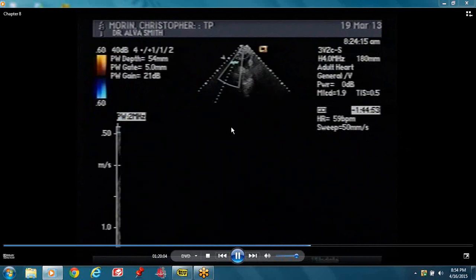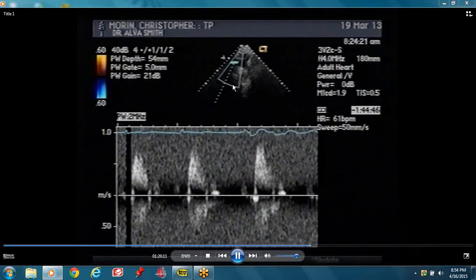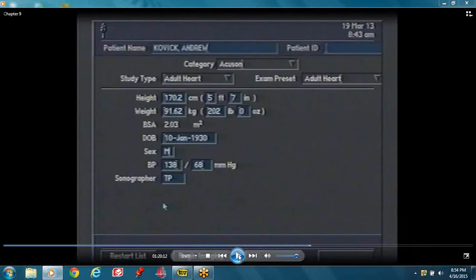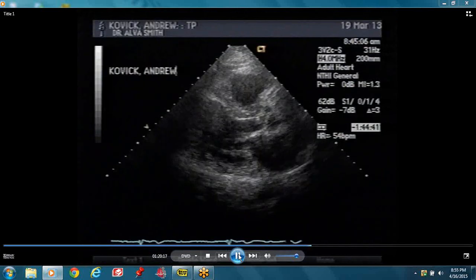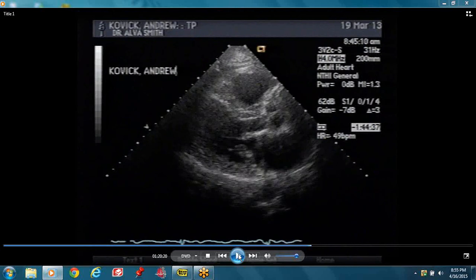The blood in the ascending aorta is flowing towards the transducer, that's why it was on top. Once the blood gets into the arch and moves downwards, it's away from the transducer, that's why it's below the baseline. So you can just look at this study. A normal study — you have to imprint a normal study in your brain. So when you see an abnormal study, you can pick it out.